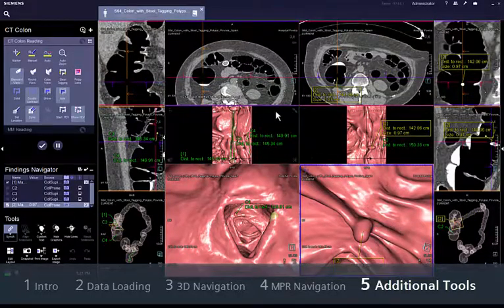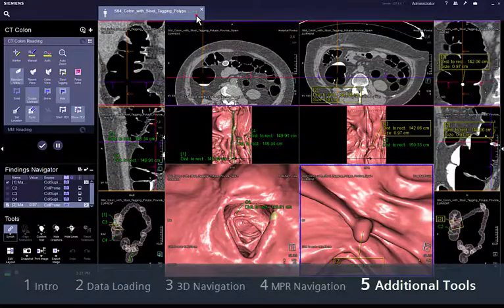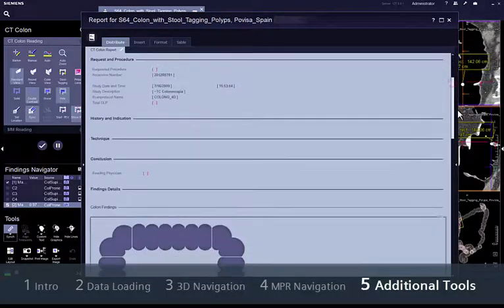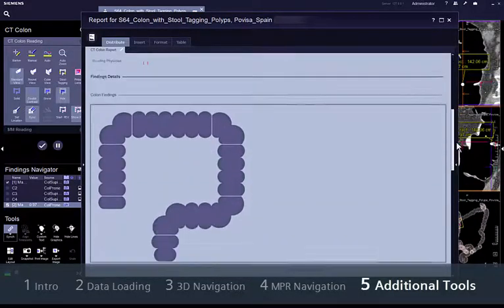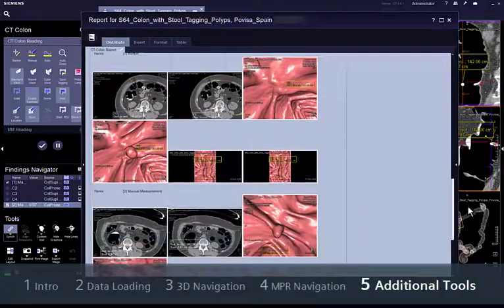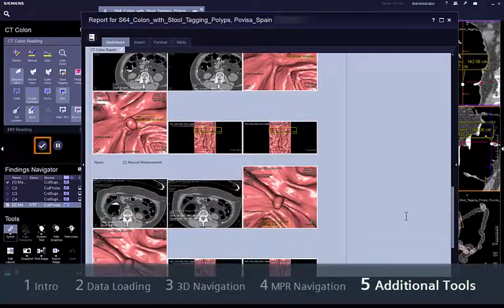All results are conveniently collected in a report compliant with C-RADS. Saving and archiving this report and the results series is straightforward — you can send the results by clicking the Save and Send button.